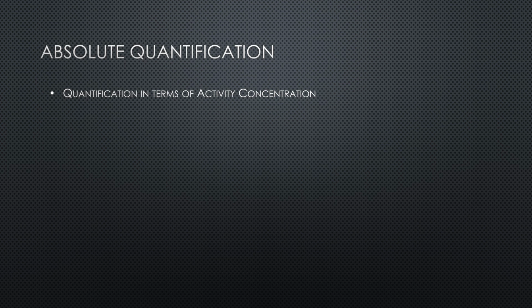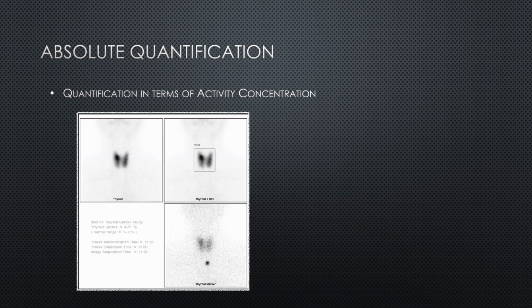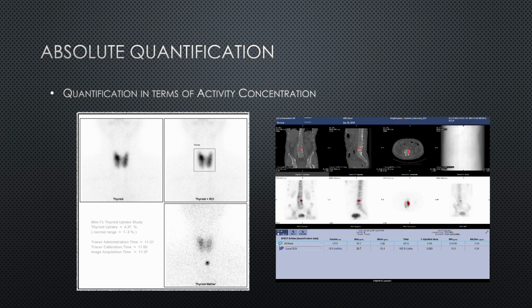The second form of quantification I want to consider is quantification in terms of activity concentration, such as that we might do in thyroid imaging, or in this quantitative SPECT example where we're quantifying absolute uptake within bone.